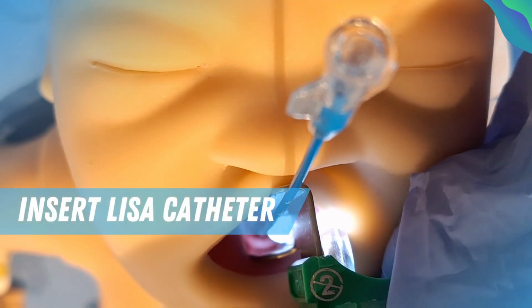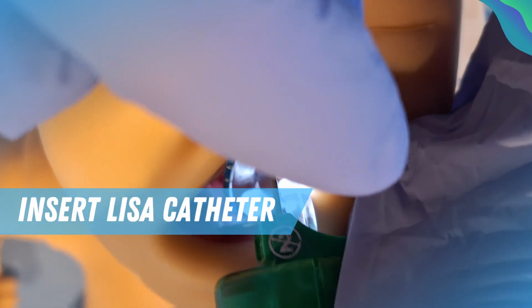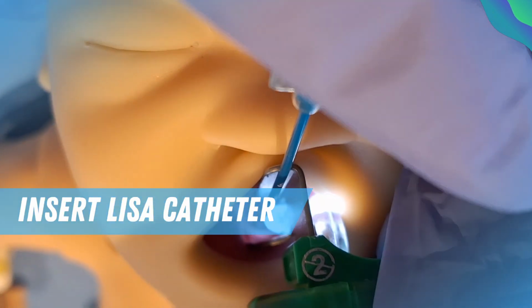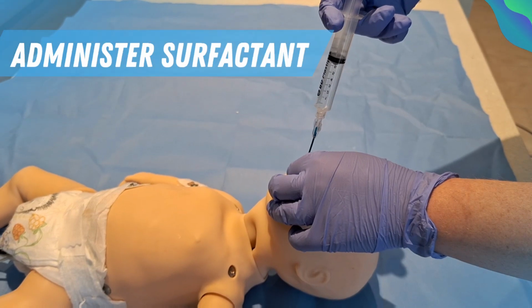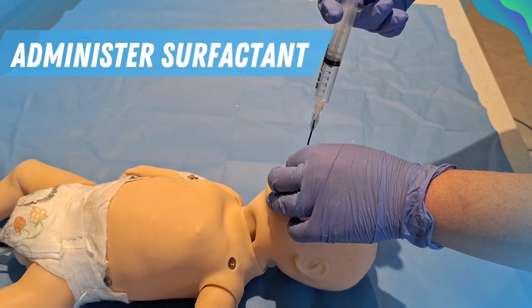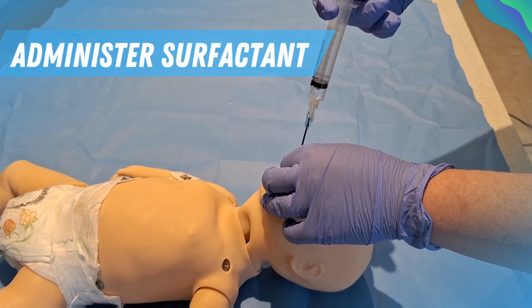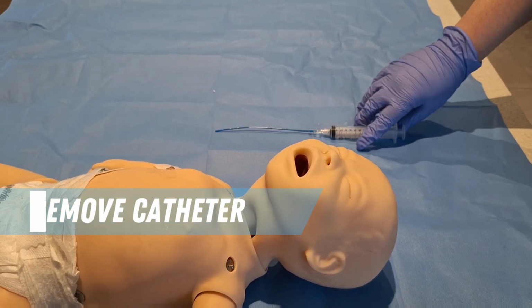Pass the LISA catheter through the cords under direct vision. Advance it around 2 cm and then remove the laryngoscope. The syringe would normally remain attached to the LISA catheter. I have removed it to give a clearer view. Hold the LISA catheter firmly in place. Get a helper to slowly inject the syringe of surfactant in small quantities over 2 to 3 minutes. The LISA catheter can now be removed.